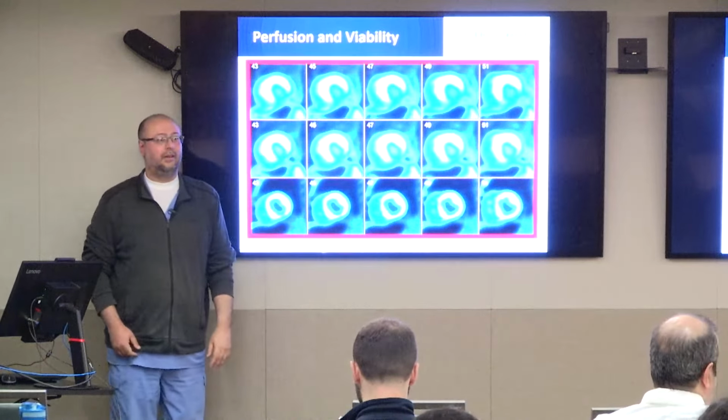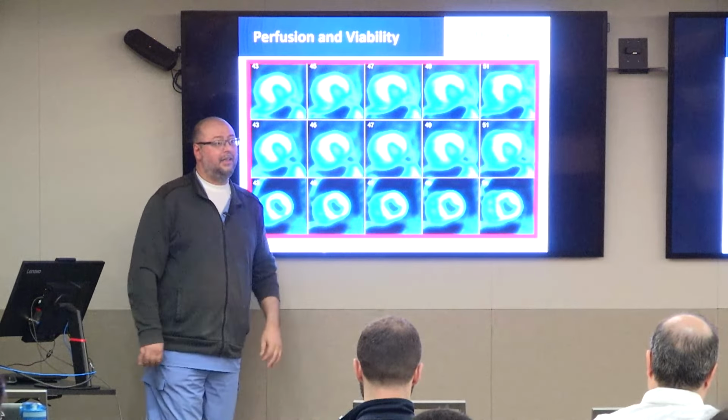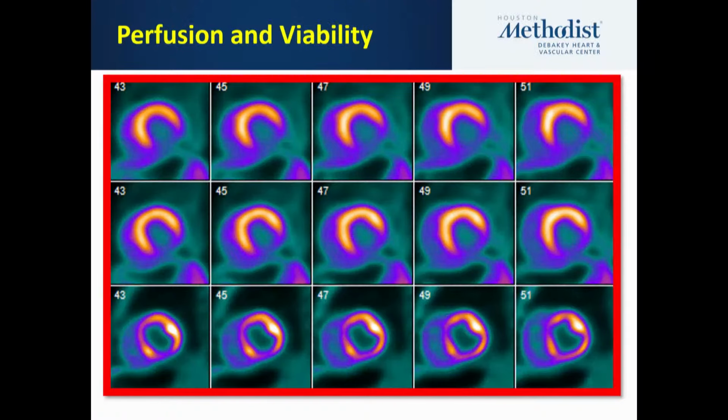Can we look for a pacemaker or ICD infection? Sorry? Can we look for pacemaker or ICD infection? Yeah. Can we differentiate a thrombus from vegetation? I mean, thrombus versus vegetation, if it's a hot vegetation, you should be able to see it.